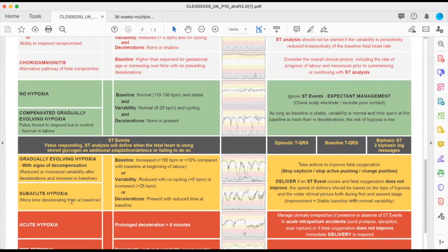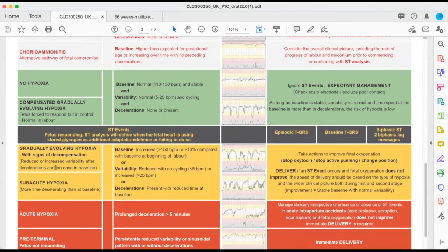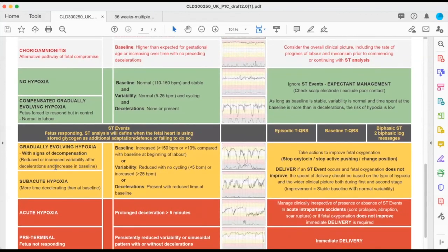Can you see where I'm pointing? Can you see my mouse? No. So can I, no, you can't see my mouse, or no, I can't start it on this baby?